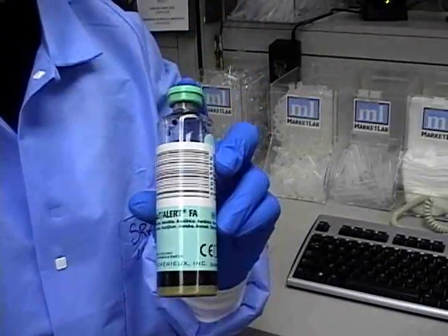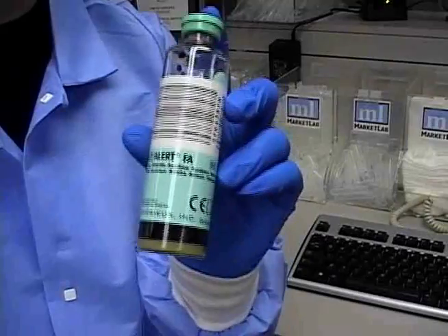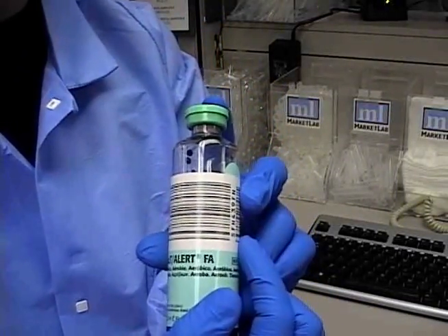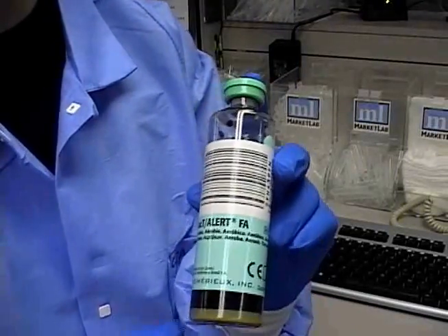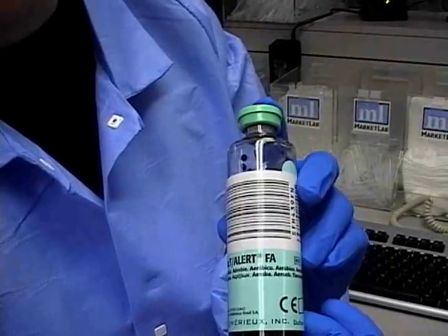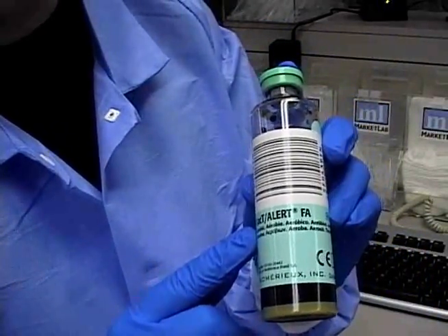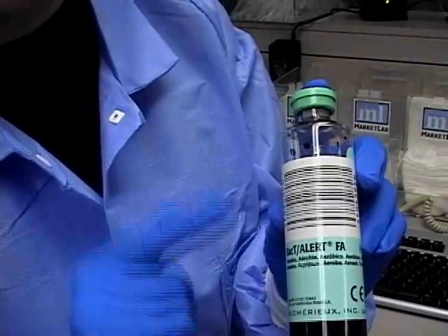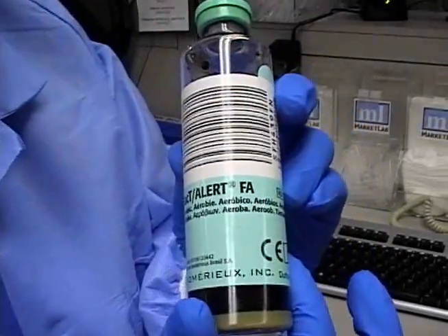Blood culture bottles are another area that we have issues when labeling. This top part here is a barcode. We input this into our machine to help us track the specimen. Labeling should be right around this bottom area where it says what kind of bottle it is. We know what kind of bottle it is by the color. The proper way to label it is around here, like so.